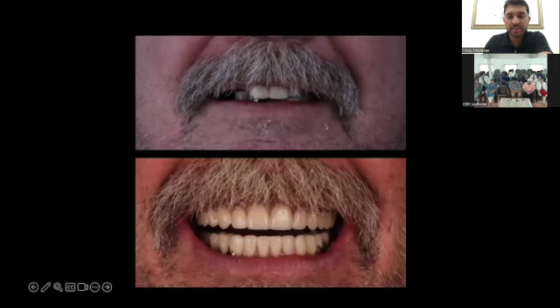Again, with patients aging, they don't always show the maxillary anteriors. As they age, they end up showing the mandibular teeth more. But the most important indication is when they smile, you want to make sure you have a nice even occlusal plane. Compared to where we started off, the patient came in with teeth that were a little bit more protruded. The incisal edge position seemed a little bit longer. In the beginning, when the patient smiles, you barely see the gingival areas. But as I told you before, as you progress into the treatment and the patient gets more comfortable with you, they usually smile a lot more.